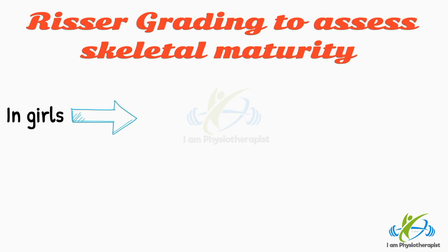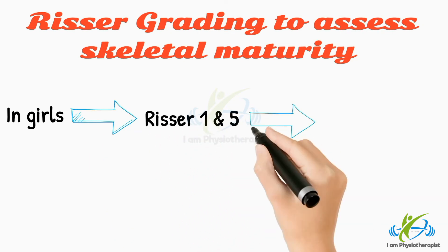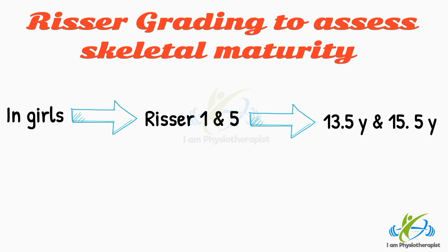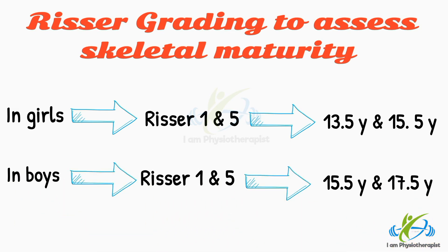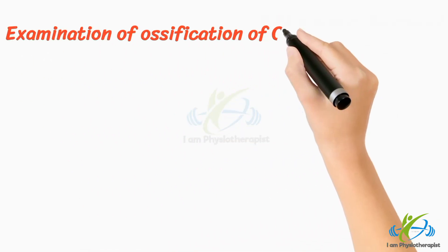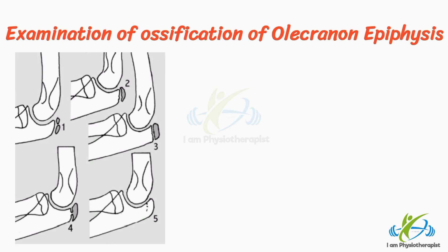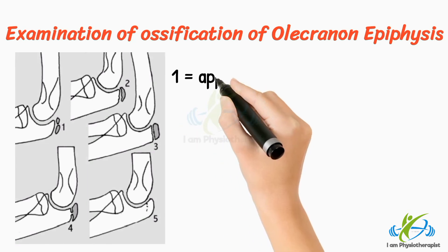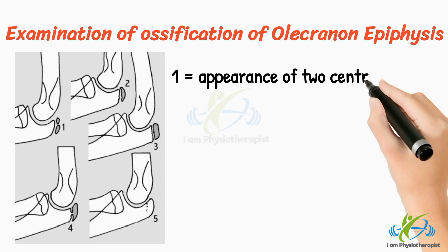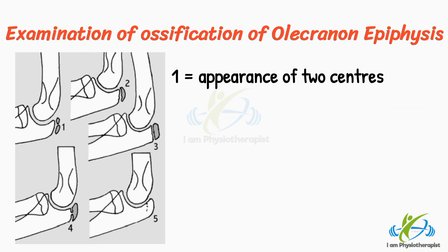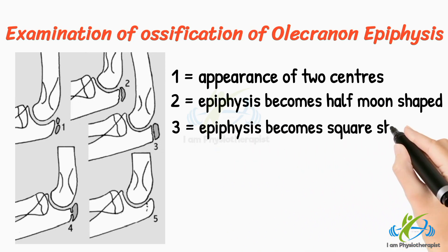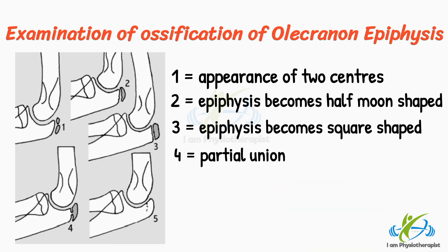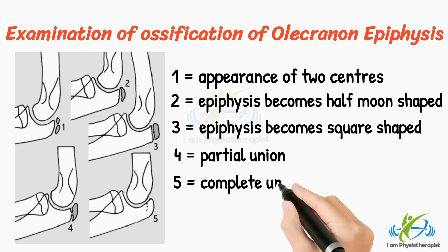In girls, Risser 1 and 5 commonly occur at ages 13½ and 15½, and in boys at 15½ and 17½. R4 shows the apophysis becomes half-moon-shaped; then square-shaped; then partial union. R5 shows complete union.